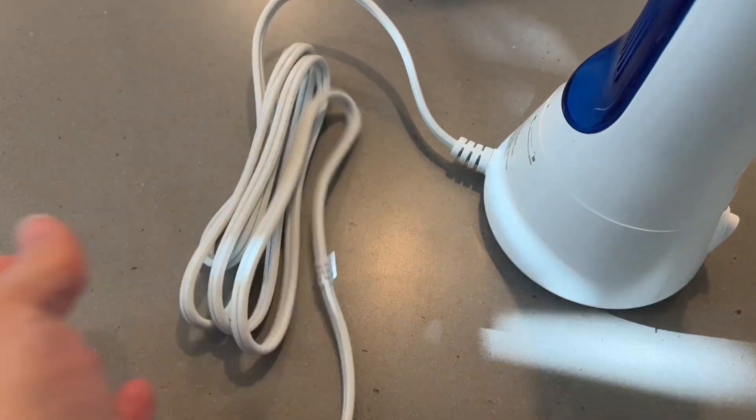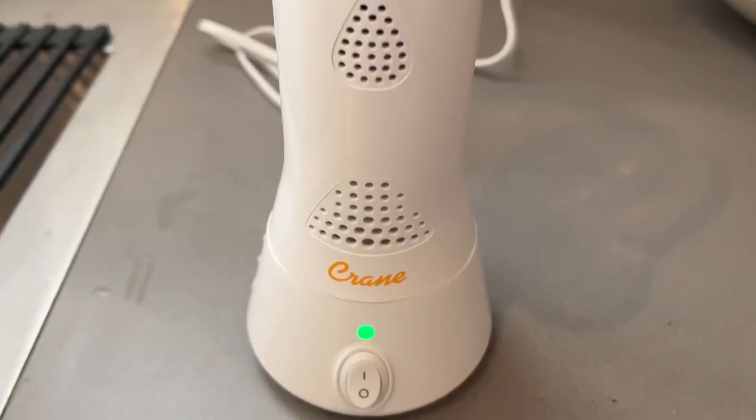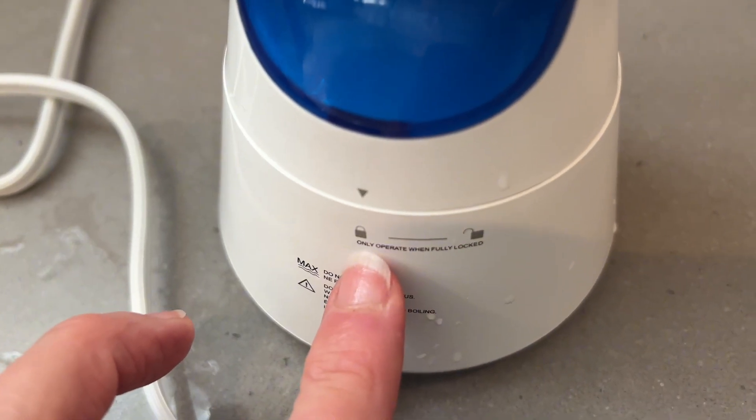It has a very long cord. You simply twist the bottom off and fill it with water, then plug in and wait for the indicator light to stop flashing to let you know it's ready to go. Make sure that it is fully locked into place.